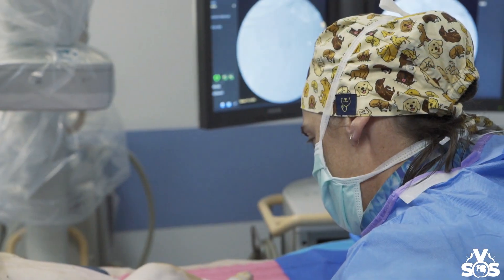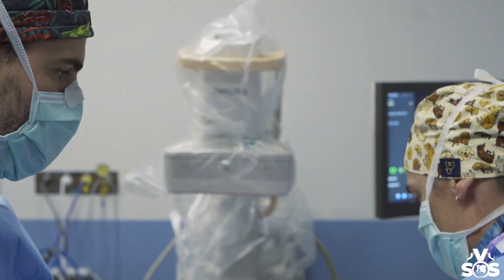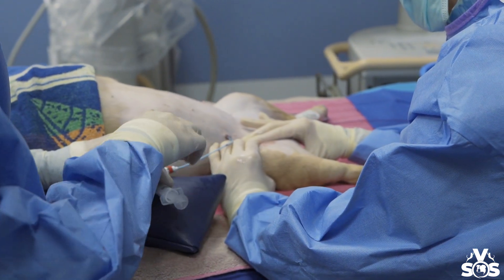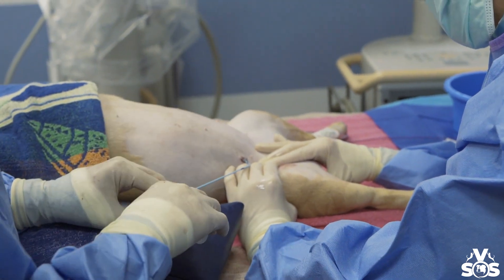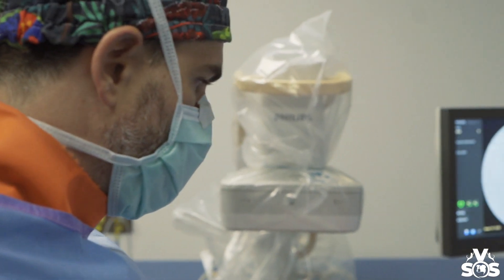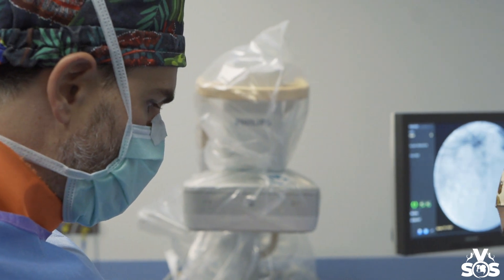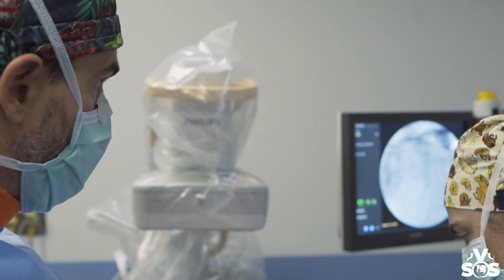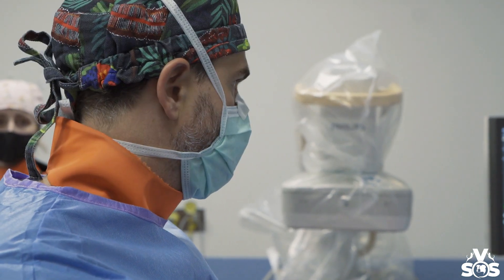We just finished the procedure. Carina just removed the access in the groin, which goes through a tiny, tiny hole in the skin. What Carina is doing now is compressing the artery we accessed to prevent bleeding — that works in most cases. The treatment was, as expected, very challenging and difficult.